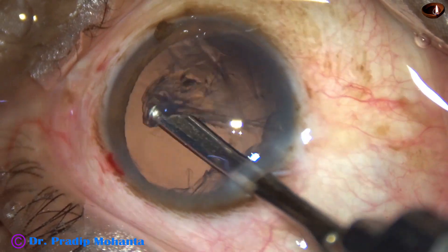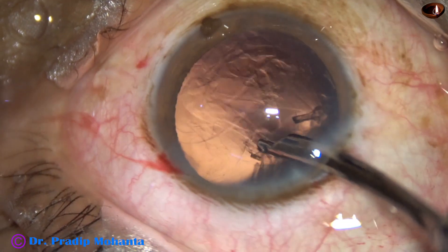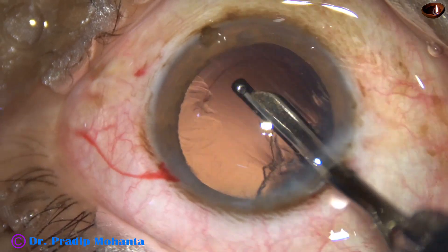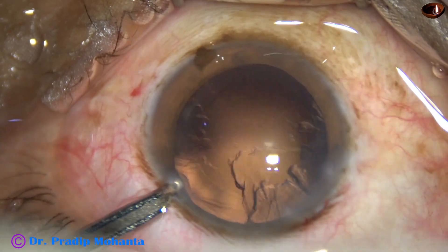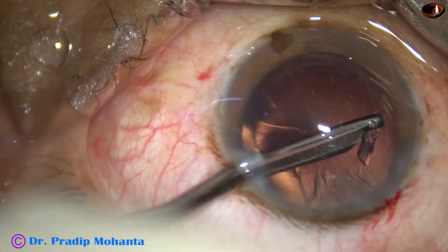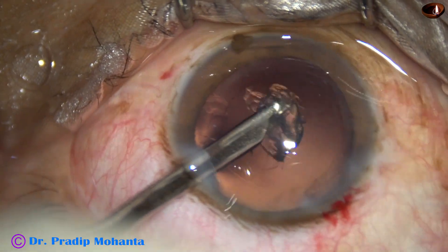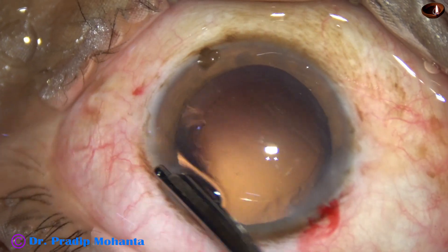The cortex from 7 o'clock is removed, the cortex from 1 o'clock is removed. The cortex from 9 o'clock to 12 o'clock is removed going through the side port. The width of this side port is about 1.8 millimeters.